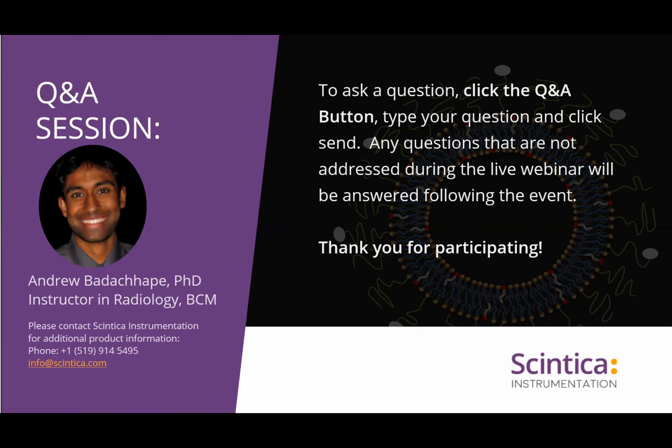I didn't show any dynamic contrast enhanced data for this presentation. We take a pre-scan, we administer the contrast through tail vein catheterization, and then we image the animal. For DCE imaging, most of these scanners, in both Aspect and Bruker, will have a port that you can attach to the catheter, and that will often be used for administering other agents, particularly agents that don't have as long of a half-life as our agent.